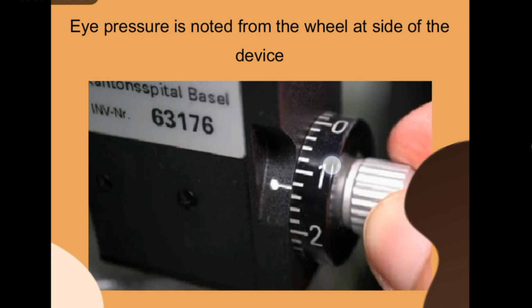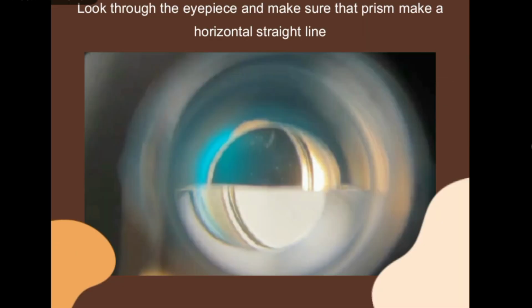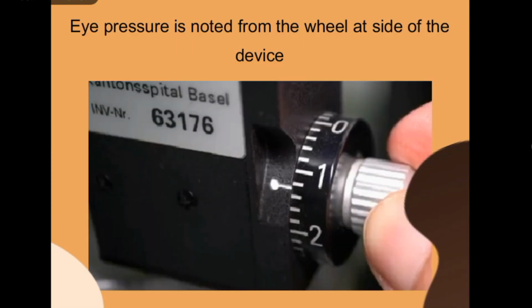Here you can see the reading is 0, 1, 2. Now are we going to say that it is approximately 1.1? Okay, 2, 3, 2, 4, 6, 10. So can we say that it is 1.1? No, it is not 1.1 or 1.2. You have to multiply these readings with 10. तो आपने क्या करना है, you have to note the readings from this wheel and just multiply it with 10, so that you can get the intraocular pressure reading.